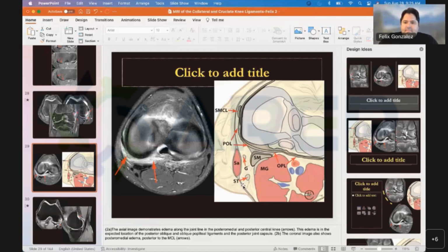I have a question. Just a very short question, but about the protocol, about the treatment, and about the report. For the protocol, do you prefer 1.5 or 3 Tesla for MRI of the knee? In my humble opinion, I think 1.5 does a decent job. Again, it depends on who you're serving.